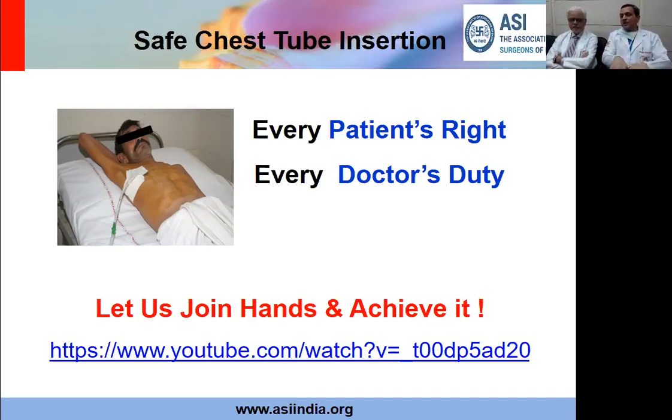Now, if it's going inside, then it would be coming out through your chest tube, and if you have more than 150, 200 cc per hour of blood coming in the chest tube, then that becomes an indication for exploration. How frequent is exploration for such inadvertent bleedings? In your long career, have you encountered such situations?